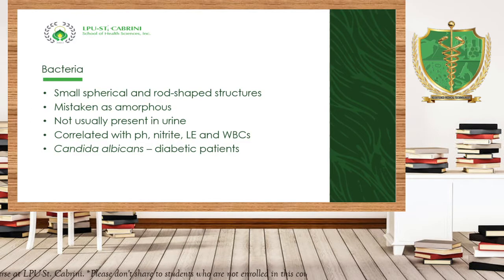Okay. So again, remember, you must be careful in examining the presence of bacteria and the presence of amorphous phosphates or amorphous urates. Now, remember this guys, bacteria cocci is non-motile, no? Non-motile yan.